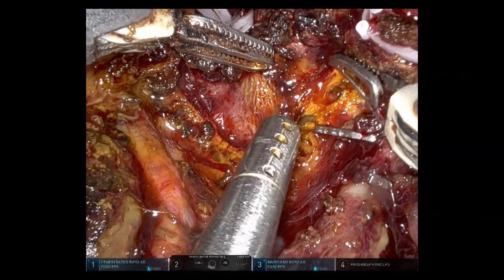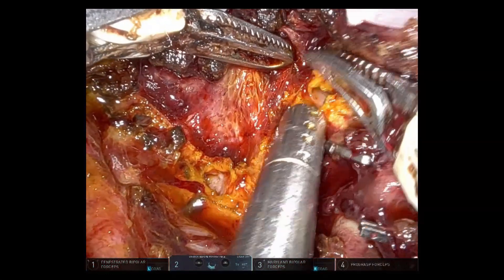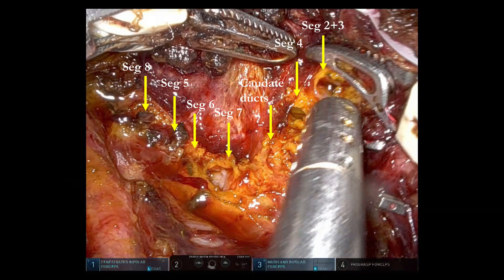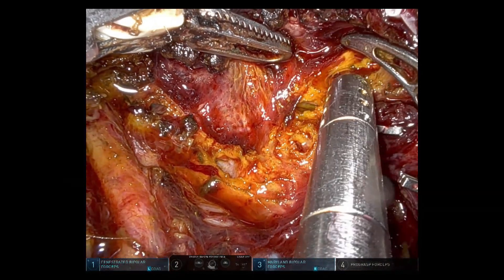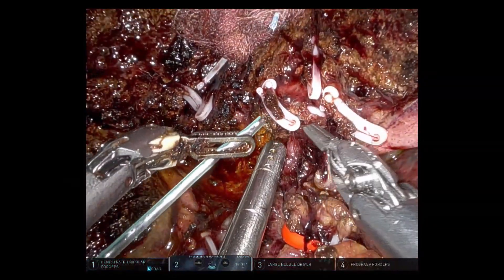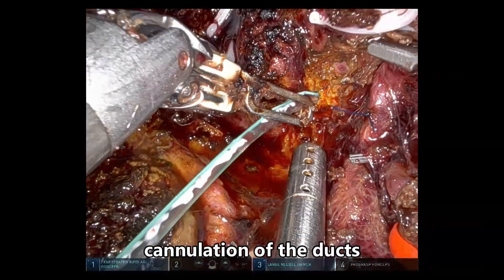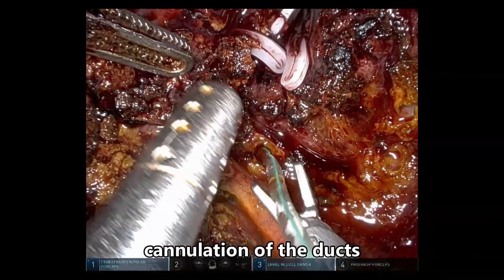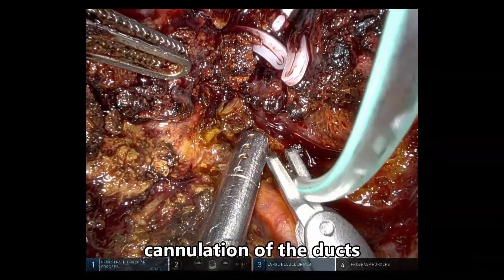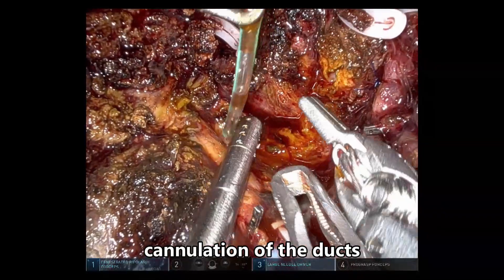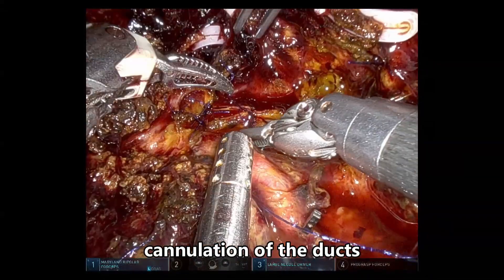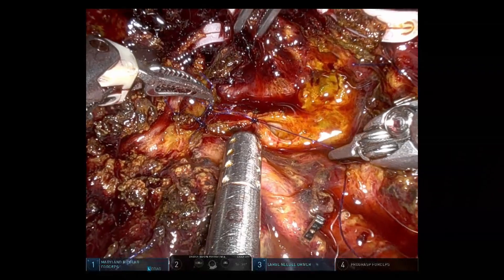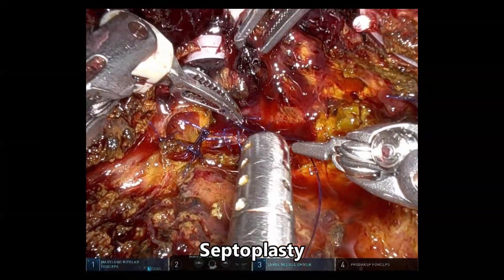We can clearly observe there are 4 ducts on the right side and 2 ducts on the left side, along with the caudate ducts. But all these ducts are in the same plane, which facilitates safe anastomosis. The patency of the ducts is confirmed by cannulating each and every segmental duct.